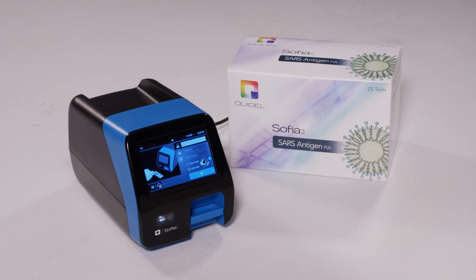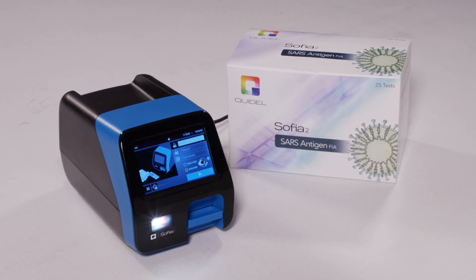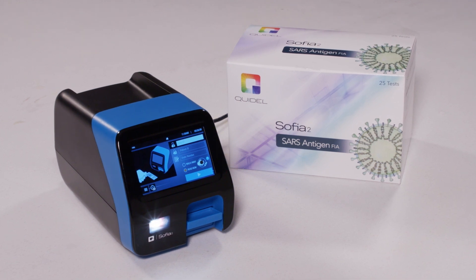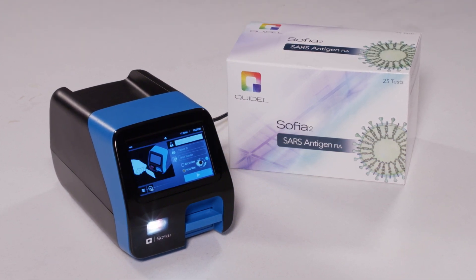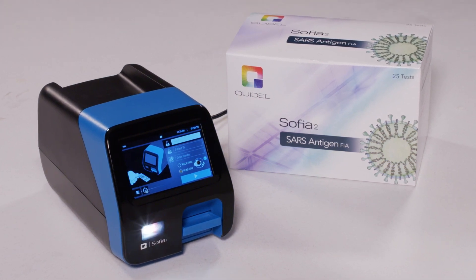Performing testing with SOFIA2 SARS Antigen FIA Test Kits in SOFIA2 is simple and flexible. SOFIA2's dual work modes adjust to your volume fluctuations and allow for significant throughput and batching in ReadNow mode.